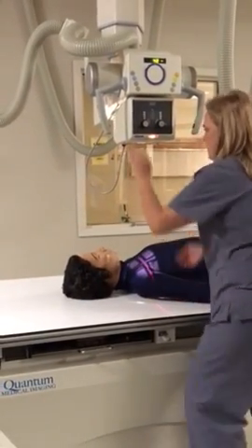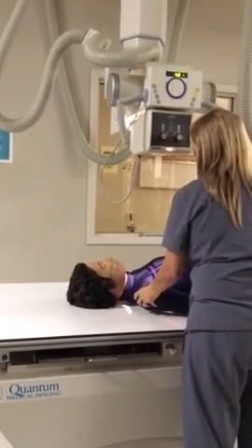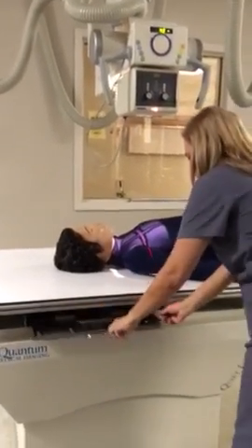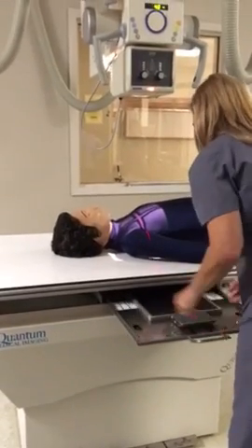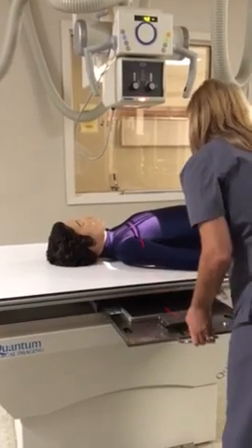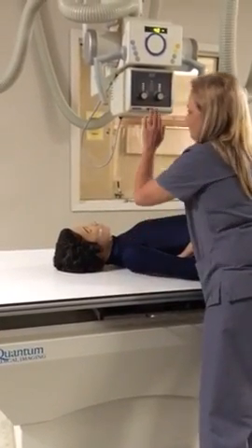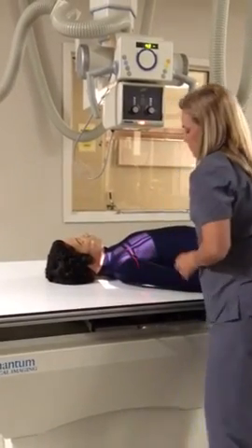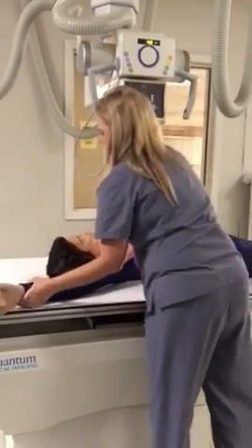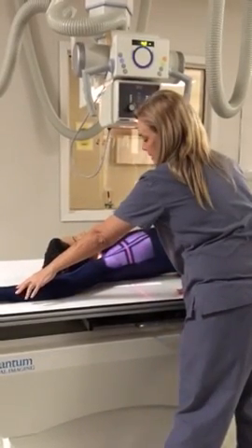And I always feel for the inferior border. That's your AP scapula.